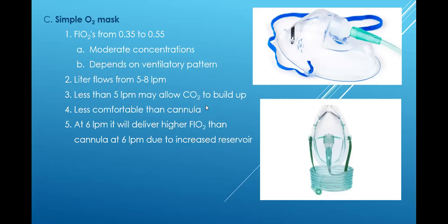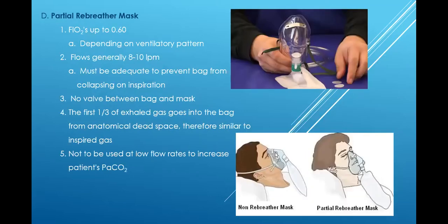That is a simple O2 mask. This is what it looks like. It's just a mask with a small bore tubing. If that isn't enough, now it's time to bump up to something a little higher. But we're still in the low flow devices, guys. We haven't gotten to any high flow devices yet. We're still in the low flow ladder.